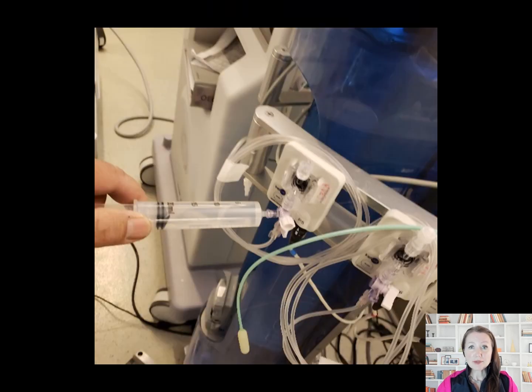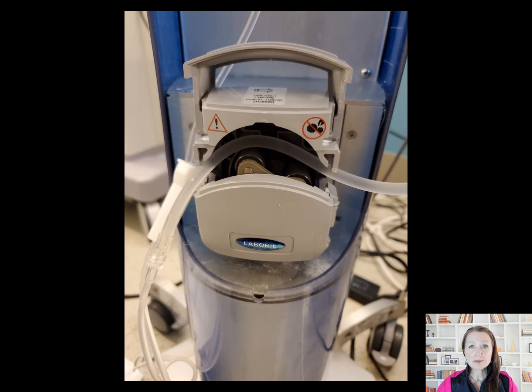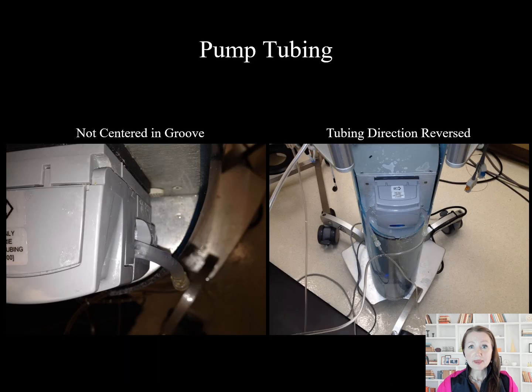The transducer is primed with sterile saline or water to evacuate air, then capped, then the measurement tubing is primed. The pump tubing is inserted according to the proper directionality. If it is poorly centered or inadvertently reversed, the fill will not proceed properly.